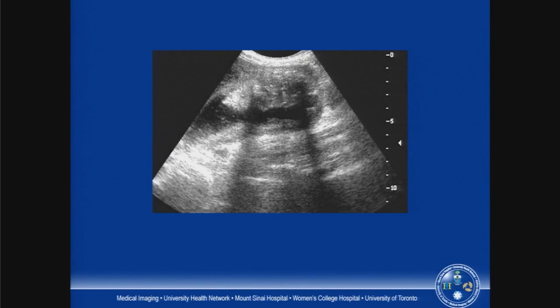So when this patient, a retired obstetrician, presented one morning with acute right upper quadrant pain, we could see the gallbladder stones. We had maximal tenderness over the sonographically localized gallbladder. The gallbladder is distended. So I was very confident that there was acute cholecystitis, but I was concerned about this additional material in the gallbladder lumen. Is it tumefactive sludge or is it a tumor?